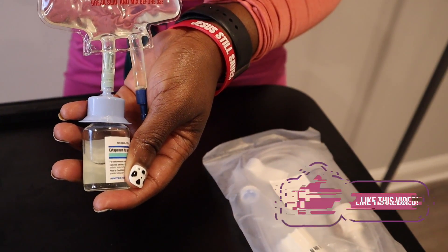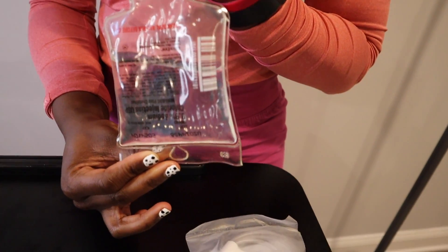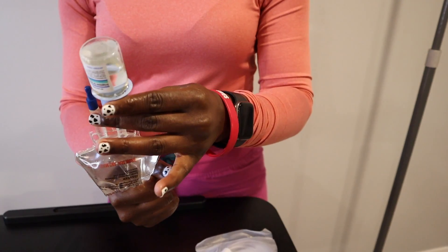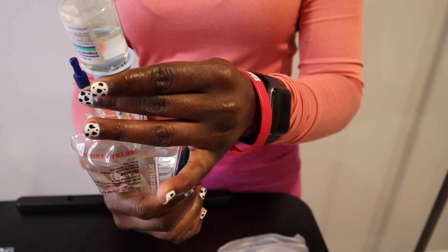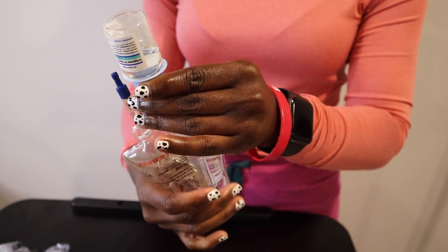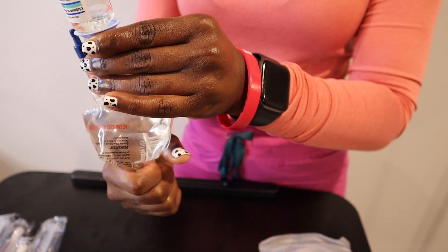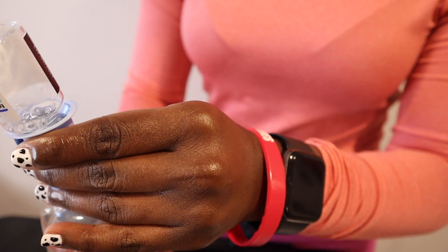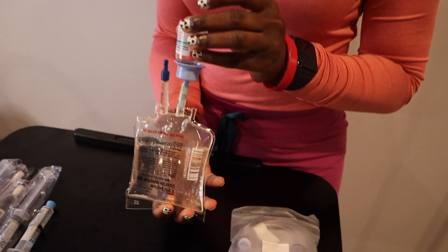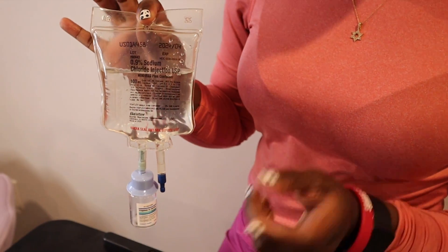Okay, so lastly, we are going to hold the bag and the vial upside down. While holding the bag upside down, we are going to squeeze the bag again. By holding the bag upside down, we are forcing air into the vial, which will drain all of the medication we just mixed in the vial back into the bag. We're just going to keep squeezing until all of the medication has been emptied from the vial and fully drained back into the bag.